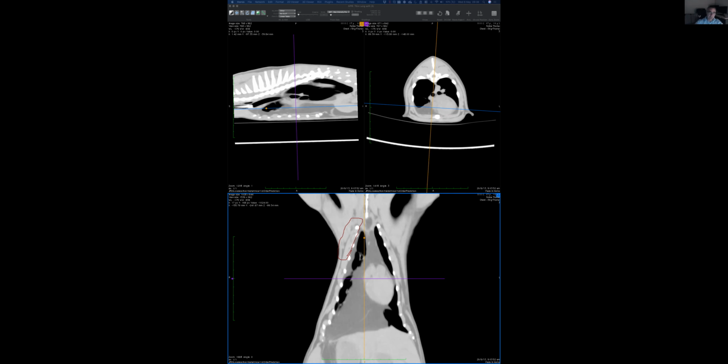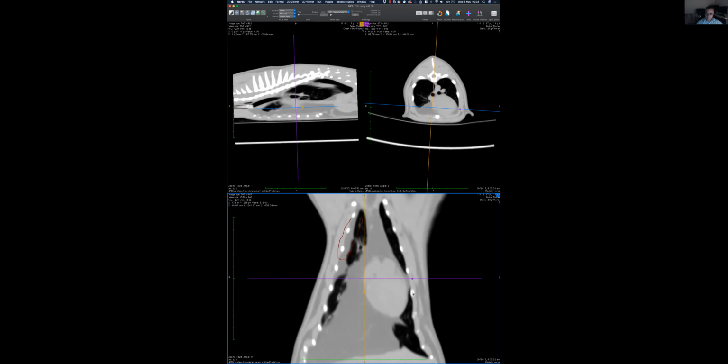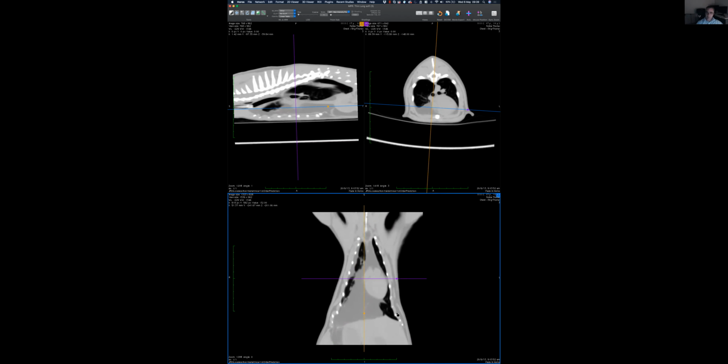So now the exercise in this case, I'm going to point out, and then you tell me the opacity. What is this opacity? Here. That's bone. What is this opacity? That's soft tissue and blood. Perfect. What is this opacity? Probably fat. Very good. What is this opacity? Yes. Okay. Now we come back to our case.